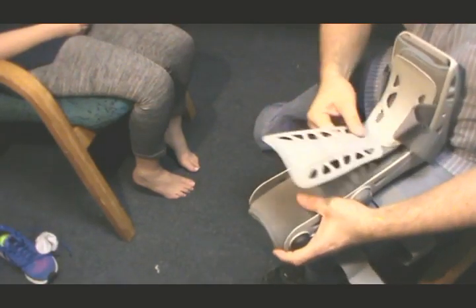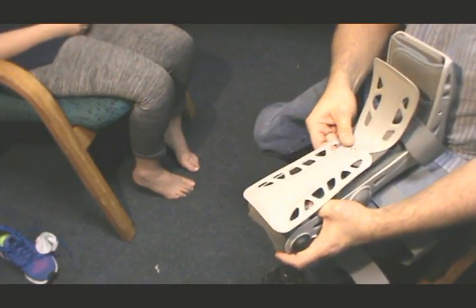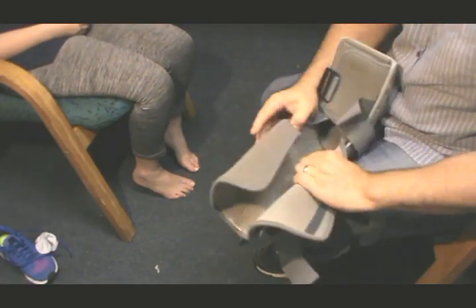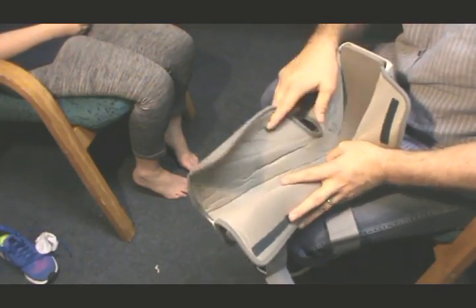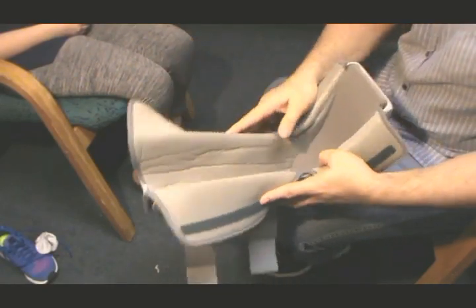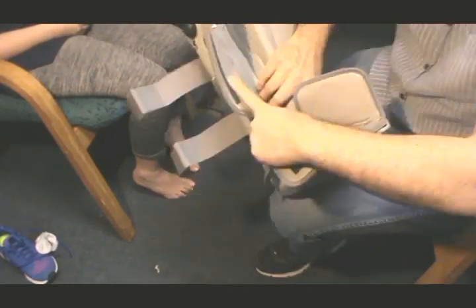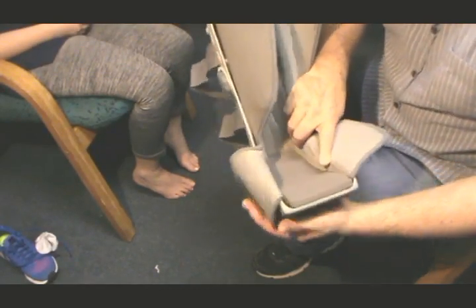Okay. And this is the front plate, so as you can see the front plate goes on last. So I'm just going to put that on the one side. And we open up the foam like this. So if you're at home and you need to put the boot on, just make sure that this bottom part is nice and flat. Right there. So I'm just going to open up that, and you can see the heel is in there.